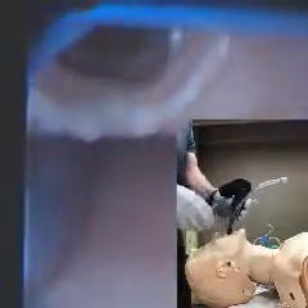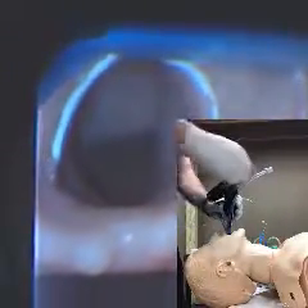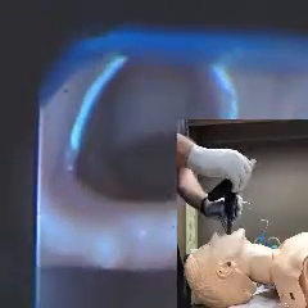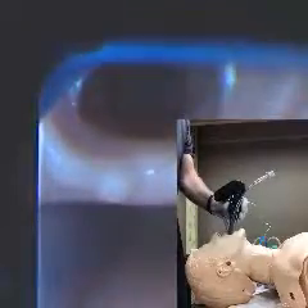As the video progresses, a lot of people are getting in very deep with the scope and they're getting a really good view to the cords. You can see the cords are really open there and you get a close-up view and it looks wonderful. However, when you're this close to the cords, what you'll find is that any attempt to push the tube in is going to go into the esophagus. So you need to pull the whole scope back out in order to get a better approach and view.